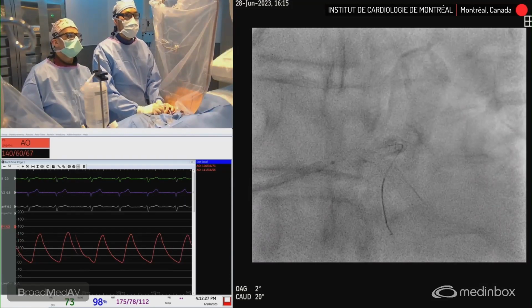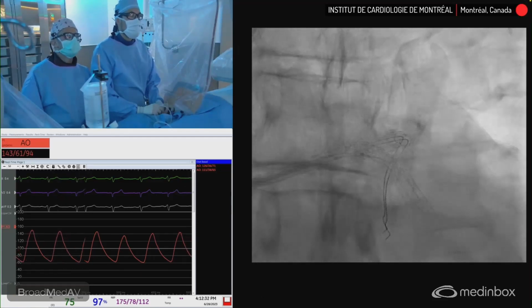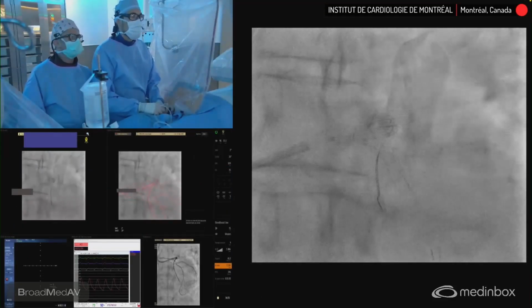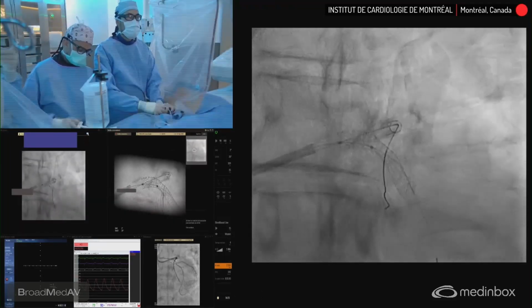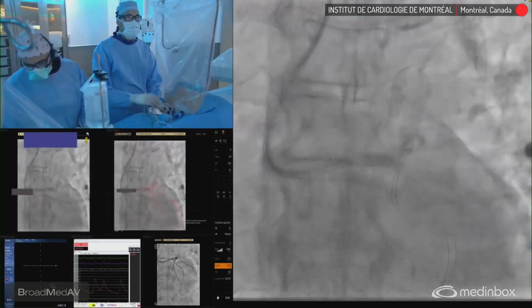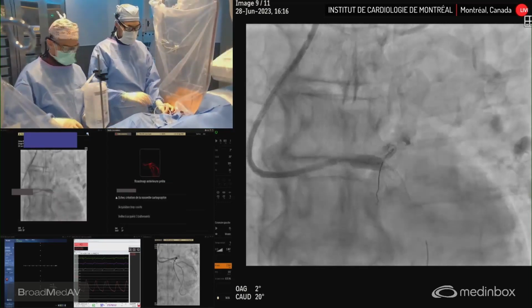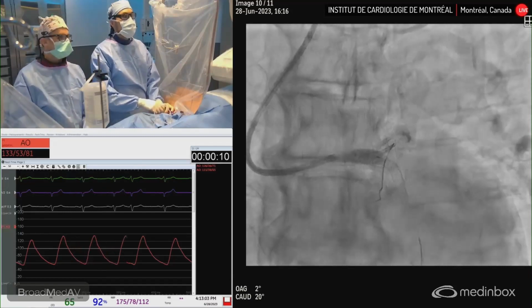A little. Diego, is it good? It's good. Go ahead. Push in. Oh, you see the stent, huh? Yeah, we see. Push. Have to go a bit further down, I think. It helps us a lot, the stent boost. Yeah, okay, go there. That's actually where we were before. You see the size of the pot, that's definitely perfect. And now maybe I take it to 16. Oh, that's perfect. Off. Yeah, it hurts, it's normal. Yeah, 5.12, 16. So it's pretty good. It was a bit above 5 on IVUS. Exactly.